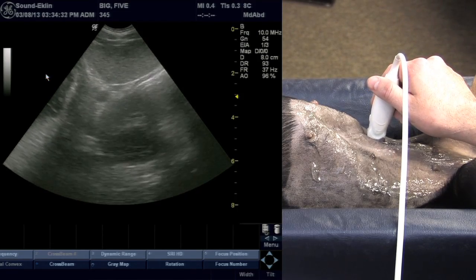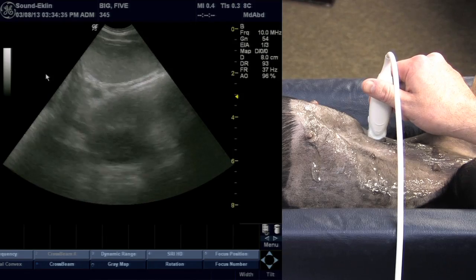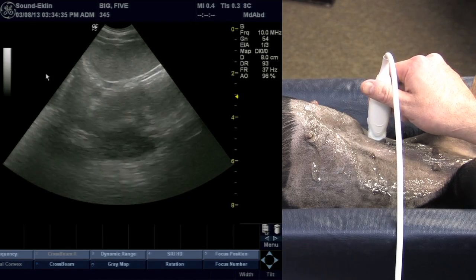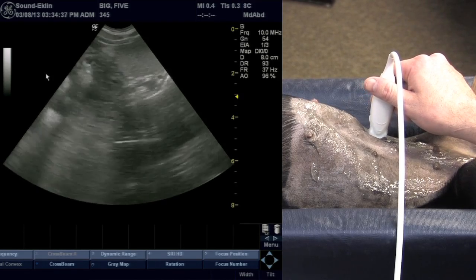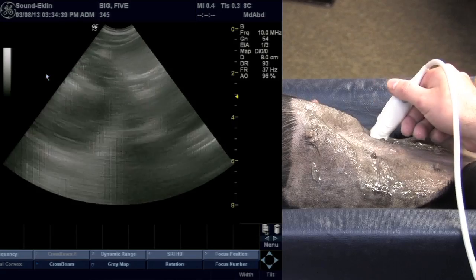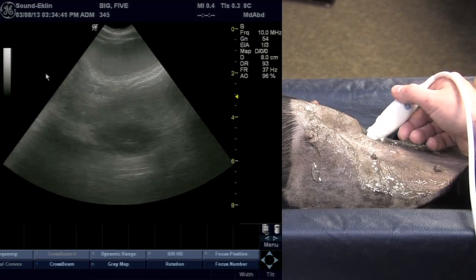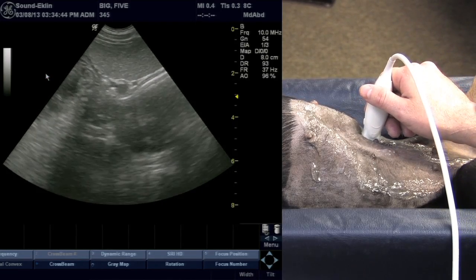We're in a long axis view of the spleen. Notice that at this point my probe is straight up and down with the patient's body. I no longer have an angle to it, so I'm not fanning cranially — I'm perpendicular to the patient.